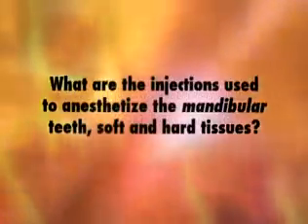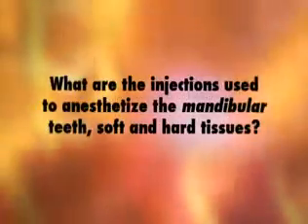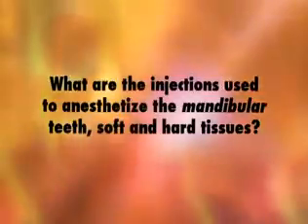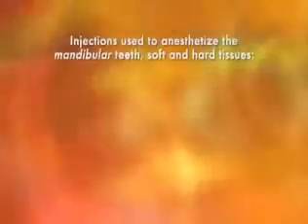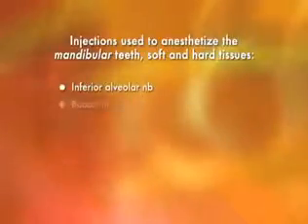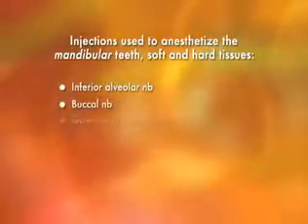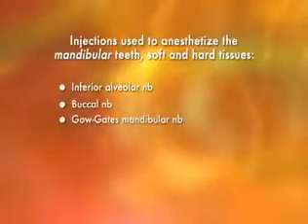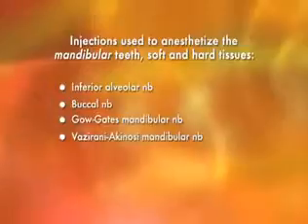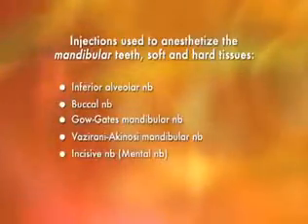We will now discuss the following techniques which provide anesthesia to the mandibular teeth and their supporting soft and hard tissues. Inferior alveolar nerve block, buccal nerve block, the Gow-Gates mandibular nerve block, the Vazirani-Akinosi mandibular nerve block, the incisive nerve block, also known as the mental nerve block.